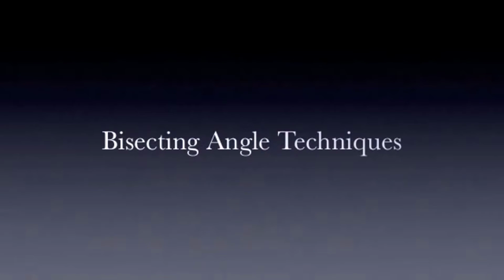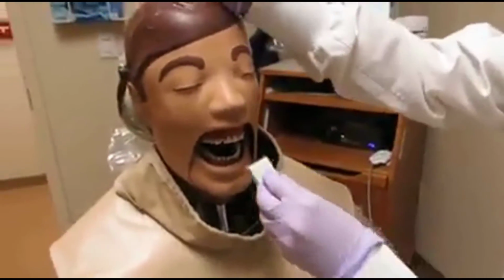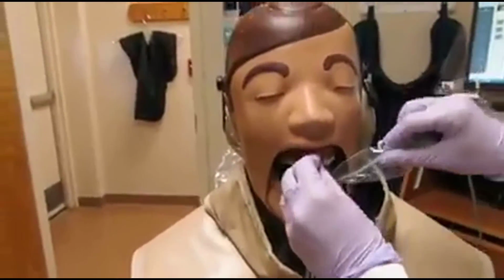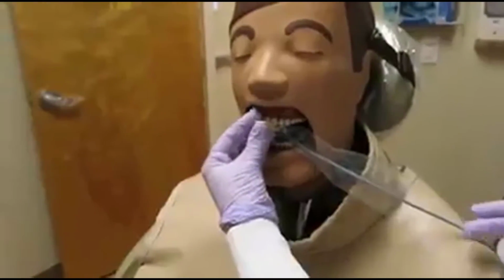In this video, we are going to demonstrate how to take periapical radiographs using the bisecting angle technique. We will begin with the maxillary incisors. When using the bisecting angle technique for maxillary exposures, place the receptor as close as possible to the teeth.